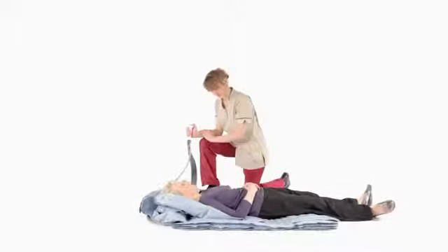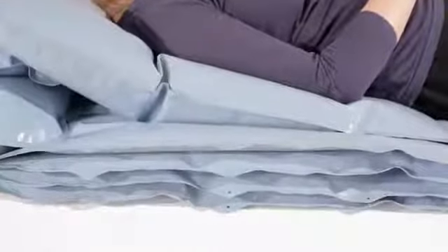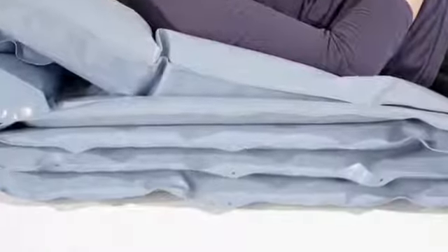For reassurance, eye contact can be maintained throughout the entire lift. Press and hold number two — this inflates the second section. The air will automatically stop once the section is fully inflated.